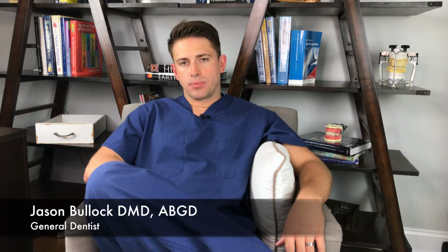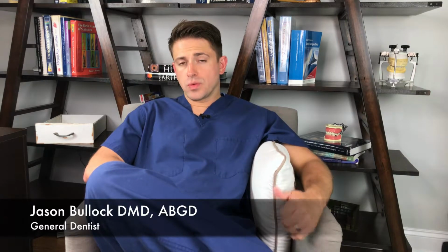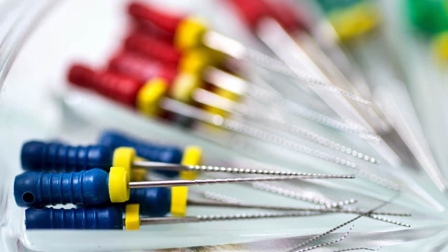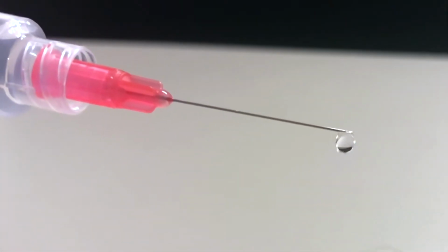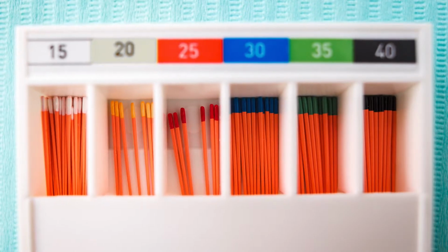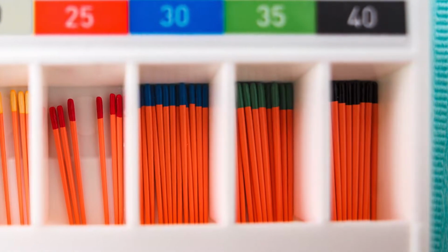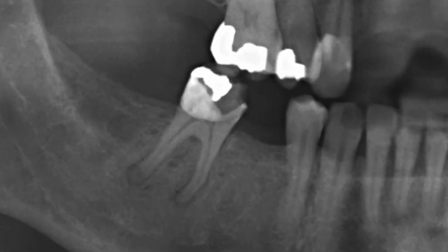So when we do a root canal procedure, we have a few goals that we're trying to achieve. First, we want to mechanically debride those canals. Then we want to chemically irrigate those canals. And then we want to have a complete obturation of those very same canals. The ultimate goal of root canal therapy is to prevent or to treat periradicular periodontitis.